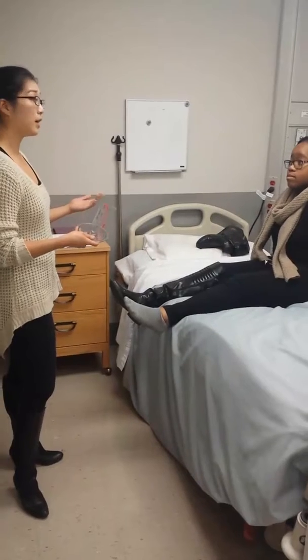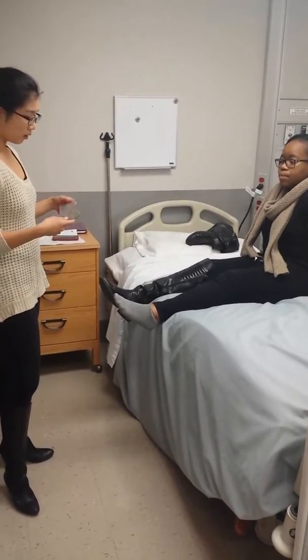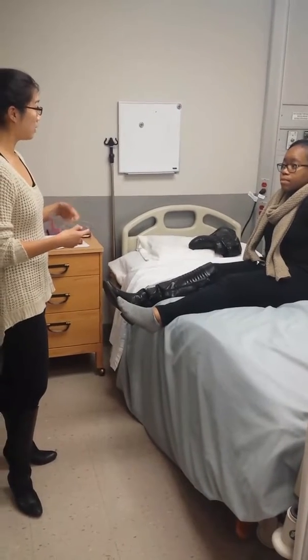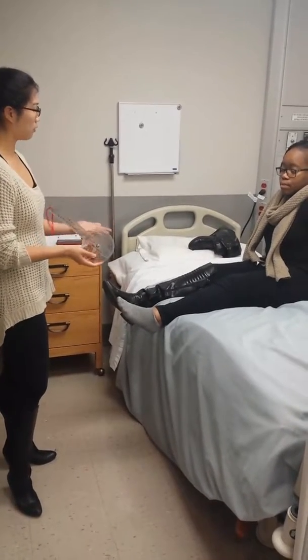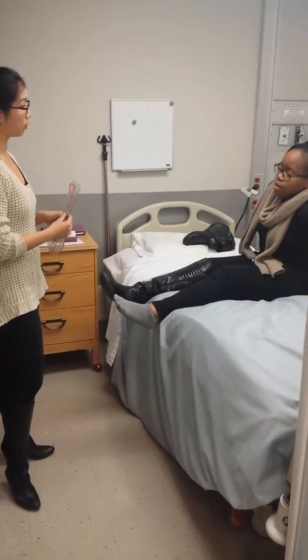So from those results, I'll just be comparing them to the average norm. This test does require me to apply this on your ankle, and some manipulation may be involved. Are you okay with my touch?